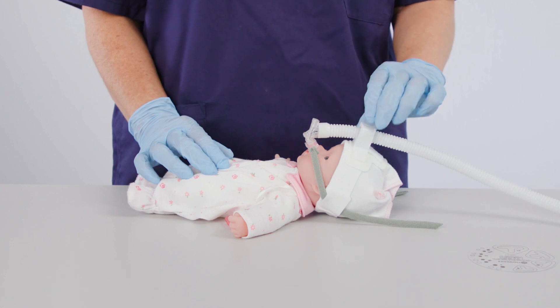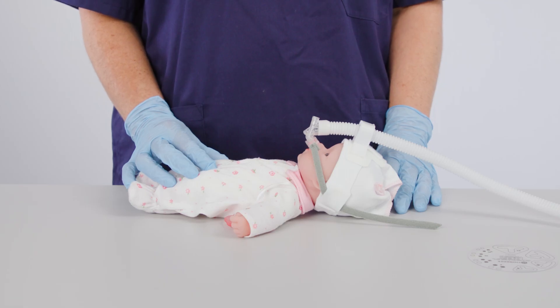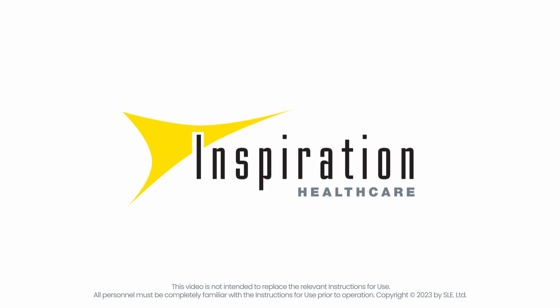If there is a leak, check the position of the bonnet and position of the generator in the fixation block. If the problem persists, review the size of the prongs or mask. If you need further information or guidance, please contact your local sales representative or consult the website.